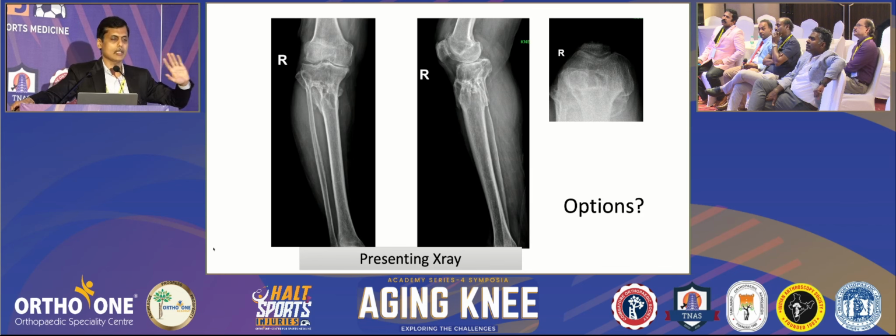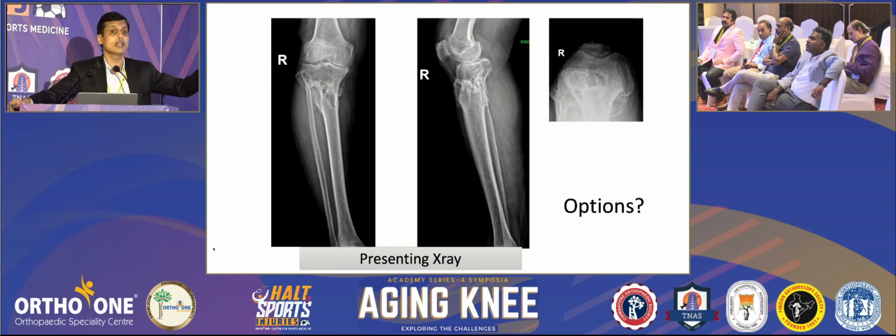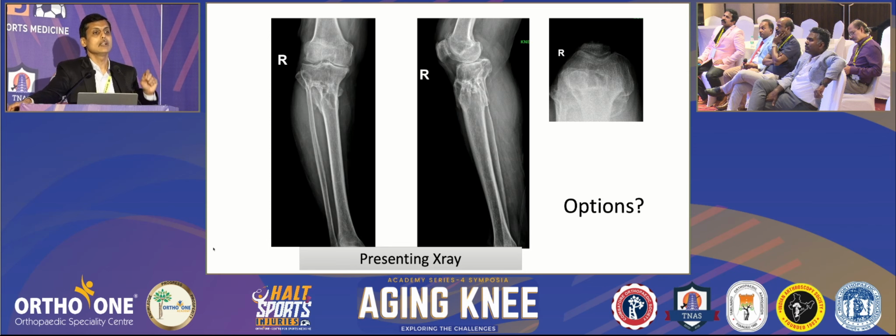That is an acceptable thing, but these are the important points: the sclerosed bone, and the lytic areas inside the proximal tibia which you have to deal with. Suddenly it might have a crack, then the sclerosis, then the slope, then the recurvatum.